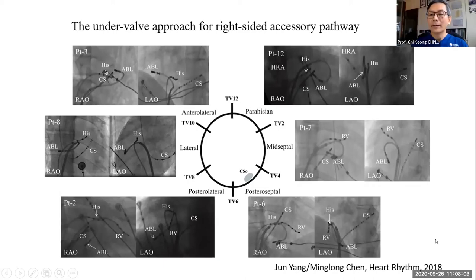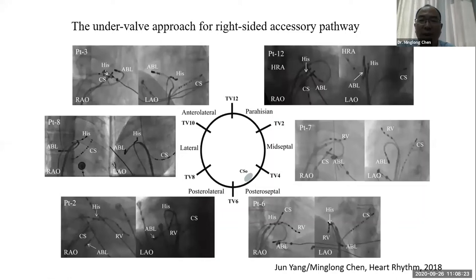I see. Okay. There are some questions. How do you define the position of the tricuspid annulus in the study? Is there a fixed A to V ratio? Yes. When you put your catheter on the ventricular side, often you have a big V. But when the tip of the catheter is close to the annulus area, you can have a small A. So like the left atrial pathway, you do the pathway mapping retrogradely, and when you put your catheter under the valve, under the annulus of the mitral valve, you can also have a small A and a big V. But here, it's a similar recording.